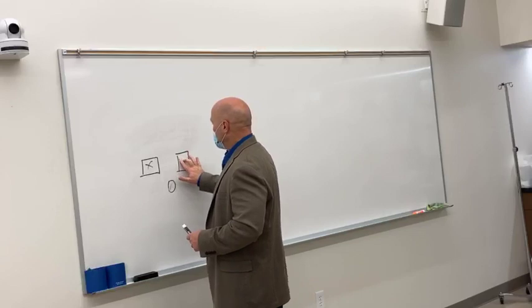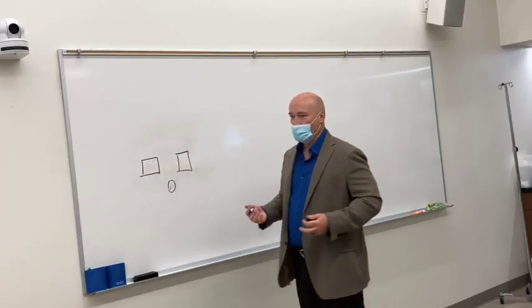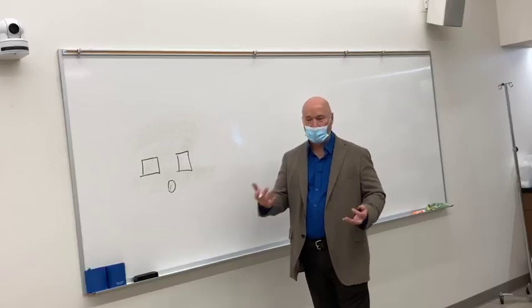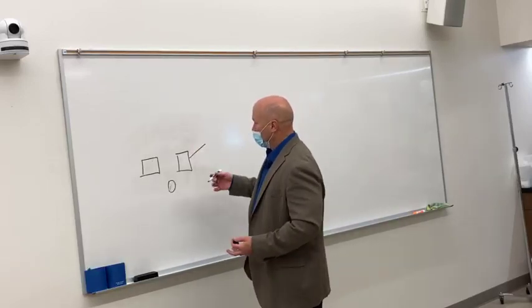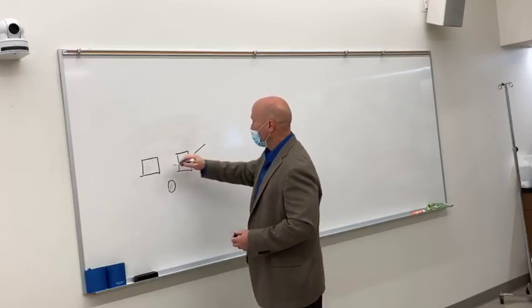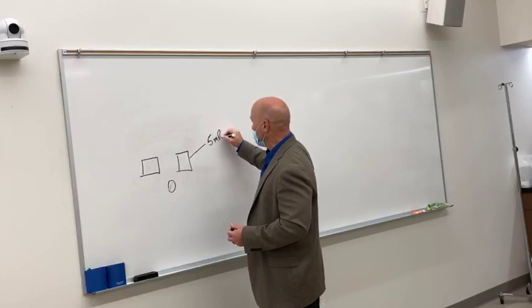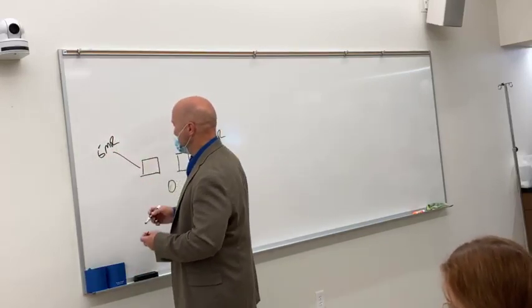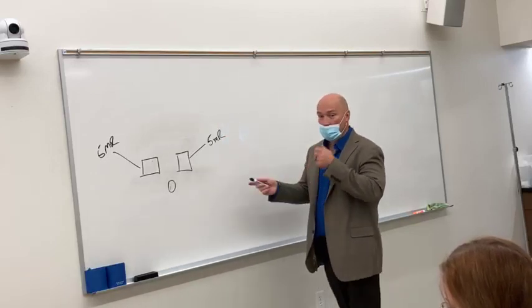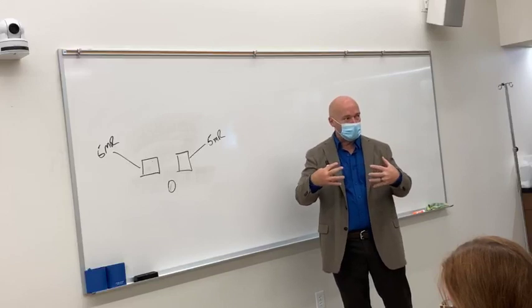So, let's say you're taking a chest X-ray on a patient. Let's say your machine is set, and understand that these are just numbers I'm putting out there. The machine, let's say, is set for your exposure timers to terminate the exposures when they receive 5 mR. They function independently, but at the same time in concert with each other.